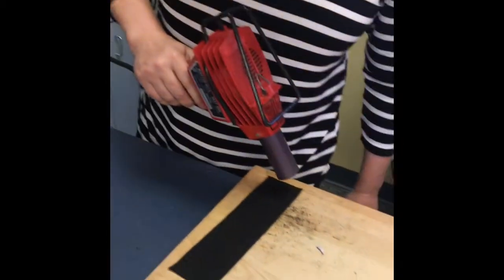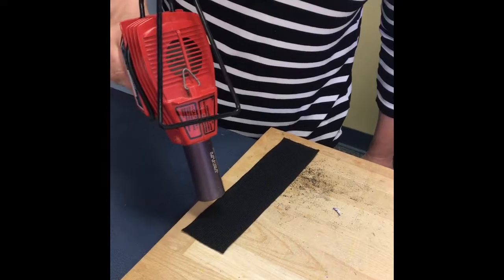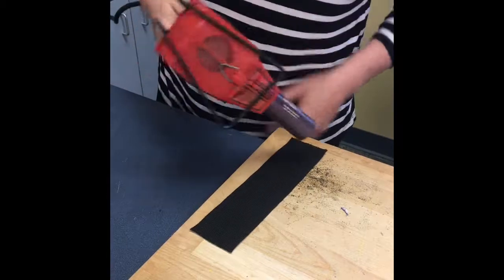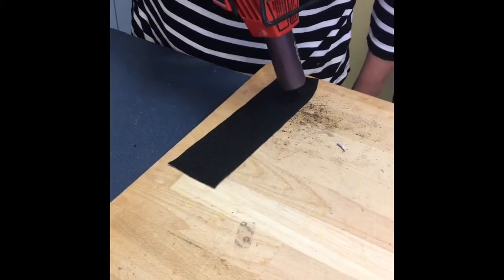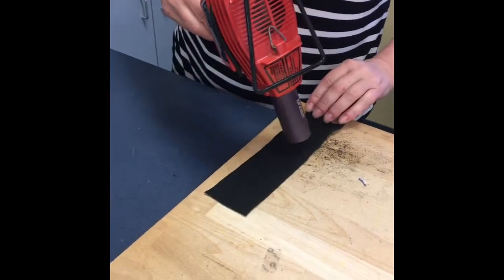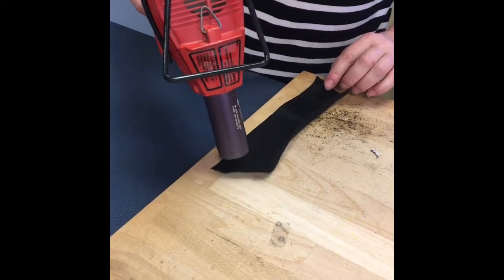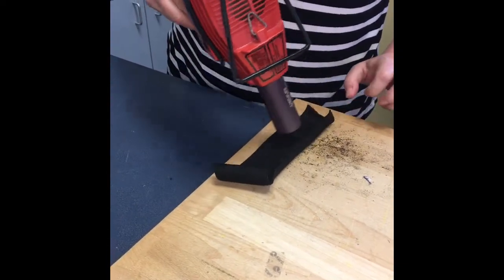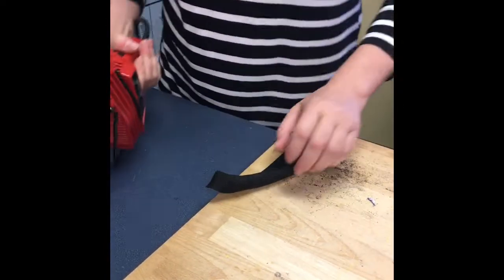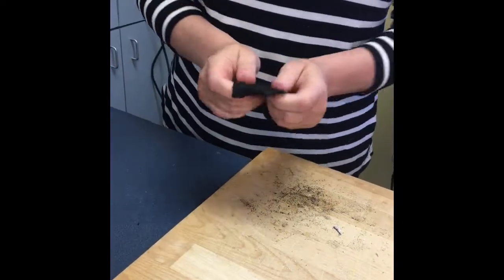We're going to heat it. This piece should be twice the length of the finger when heated. Once it's thoroughly heated, we're going to fold it in half and stretch it out a little bit.